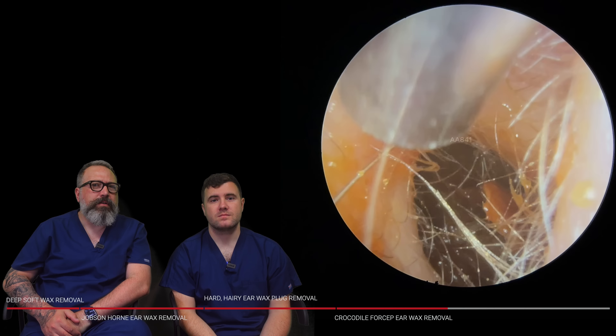There's a bit of resistance there — it's quite hardened up now. You can kind of see the skin pulling with it as I'm trying to pull this out. As well as it being quite a long plug, the start of this is also a little bit wide, so we're having to squeeze it through. I could have opted for a Jobson Horn here, but I obviously didn't. The thing is if it's moving, I know you should use the best tool for the job, but if it's moving with the tool you've got, I would just stick with the tool I've got. The eardrum's looking perfect — textbook. Little porcupine-y kind of wax, with the hairy bits all chatting around the outside.